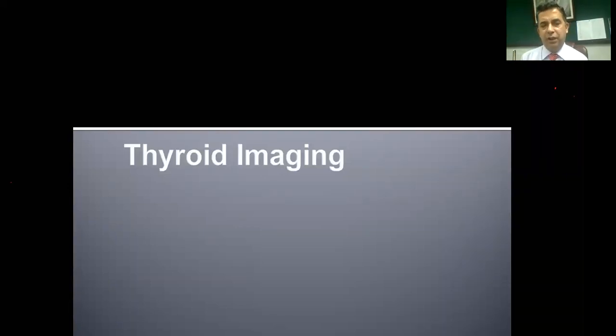There are certain other cells that also concentrate a bit of radioactive iodine, but they don't store it for a very long period of time. They do take it up, and these include the parathyroids, stomach mucosa, and salivary glands by and large. And the surplus iodine is excreted through the kidneys. So I'll be going through how we use thyroid imaging in identifying different diseases.